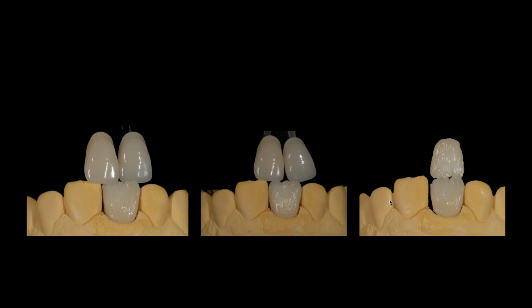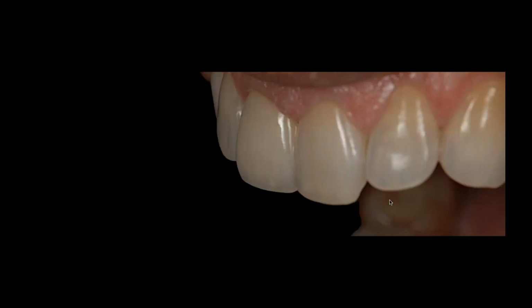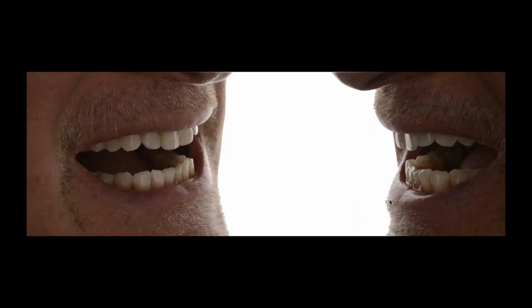And what I did as an experiment years ago was I actually layered all 3 of them exactly the same, tried all 3 of them in the mouth, and I will tell you the one that went in at the end was the most opacified. And I would argue, looking back on this 5 years later or whatever it was, that I still didn't have enough value. I still needed to push the value up a little tiny bit. So really managing your space and understanding how to create value is a critical aspect for me when I'm restoring cases.